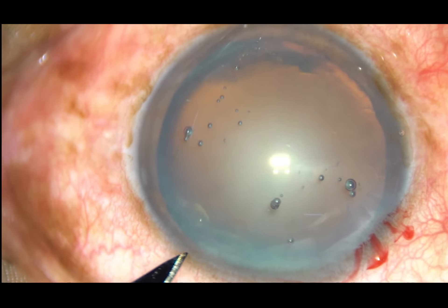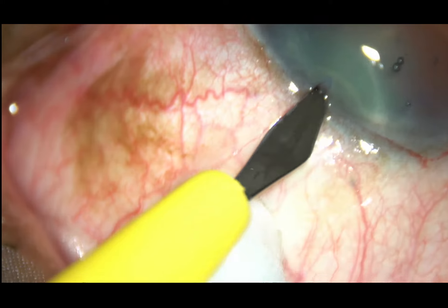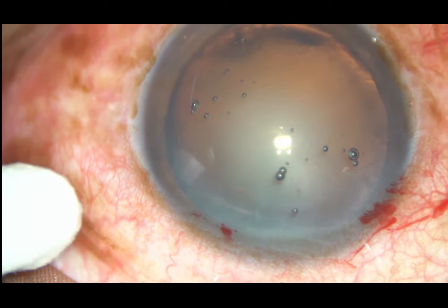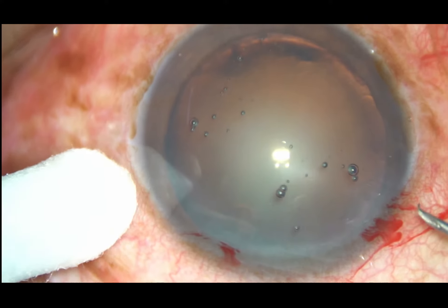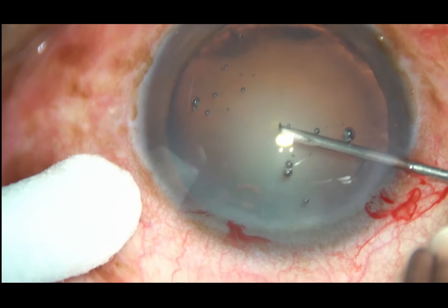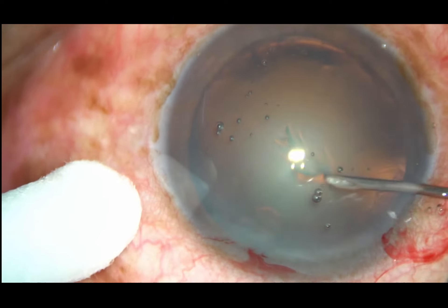This is a side port about 3 o'clock hours away from the main incision on the left side. Capsulorhexis is to be done now. A 26 gauge bent needle is introduced into the anterior chamber and the anterior capsule is incised, raising a capsular flap.